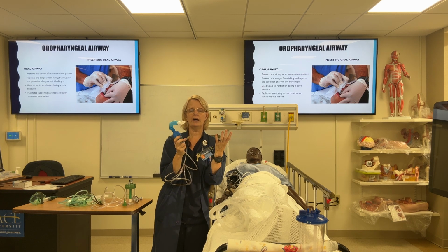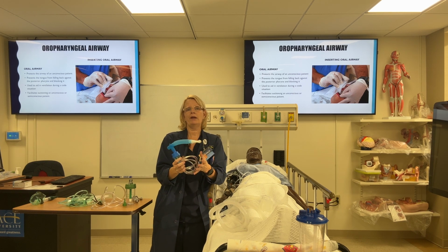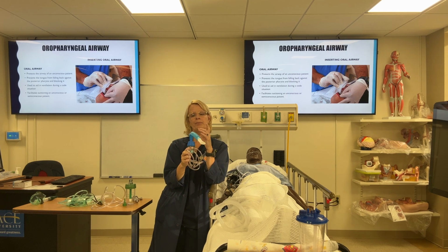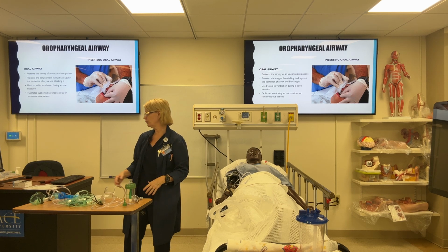Those are really effective when the patient is having respiratory distress due to wheezing, whether it's an asthma attack or whatever may be happening with the patient. Sometimes you can also use these with a little bit of saline if you just need to give humidification only and no medication, if the patient is really dry, as a comfort measure.